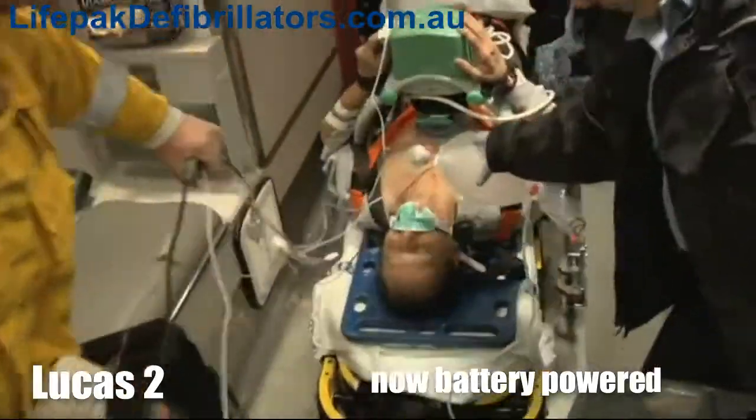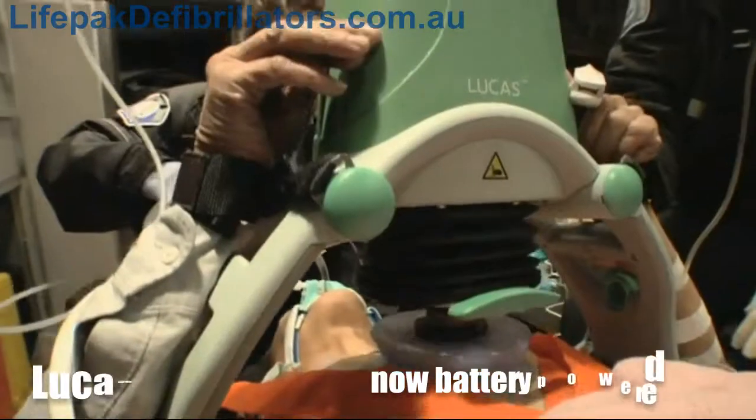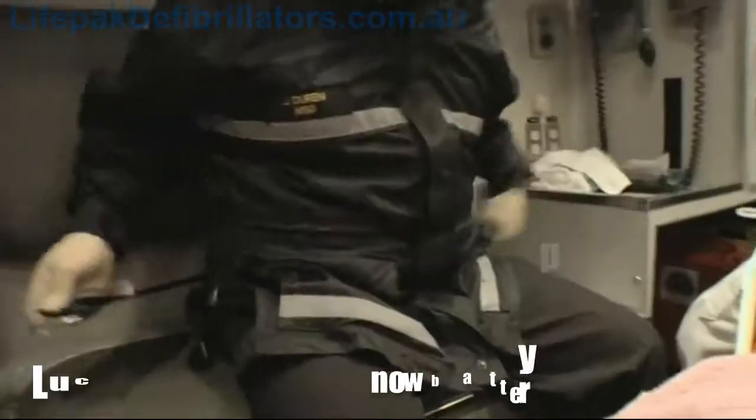Lucas allows for effective compressions during patient transport and safety for both the patient and personnel.